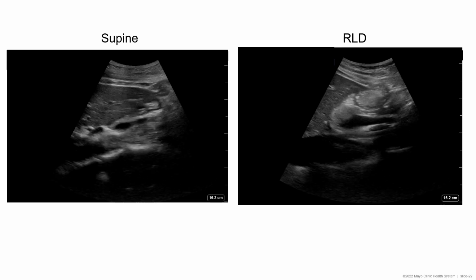And here, let's look. Can you find the stomach just distal and tucked under the liver tip in the supine position? See the hypoechoic ring of the gastric wall? What do you think of the contents? To me, it's hard to tell, so let's look in the right lateral decubitus. Here you see a solid bolus of a distended antrum full of heterogeneous gastric contents. This is suggestive of a late full stomach. Someone just ate a meal a few hours ago.